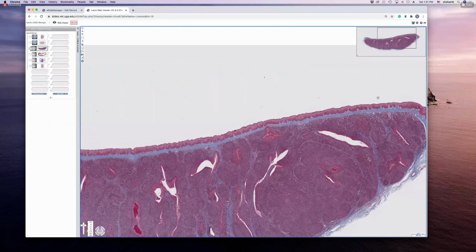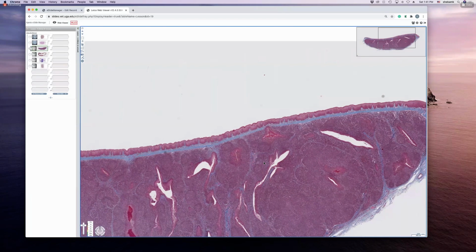Okay, so you can see nodules that are characteristic of lymphoid tissue, lots of nodules, and then you have this epithelium. Once you have this, then you can safely call this a tonsil. The tonsils sometimes have crypts, which are just invaginations of the surface epithelium to increase the surface area. So we call these spaces crypts. So that is one tonsil.